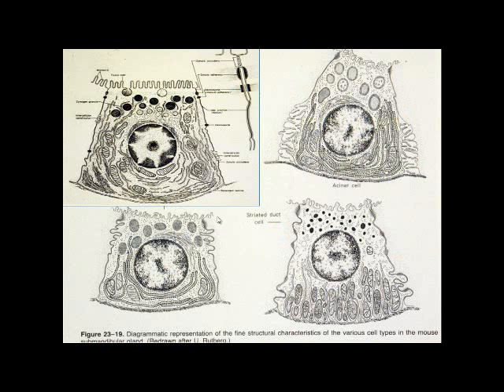And so, as I mentioned before, with epithelium in order to form a sheet, whether you're in the acinus, the intercalated duct, the striated duct, or excretory duct, you have to have these junctional complexes. So you have the zonula occludens, which prevent things from going through, from losing your saliva from the duct, and then you have these other junctions, and we'll see these junctions here.